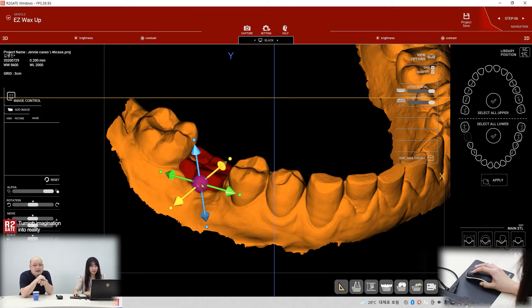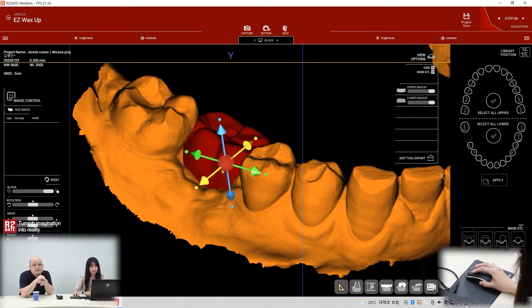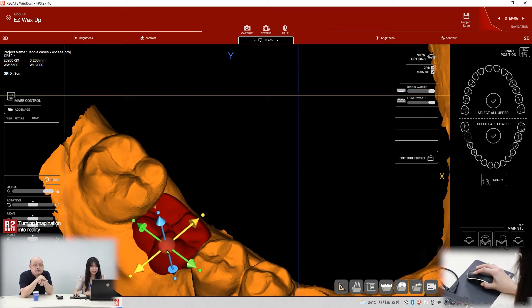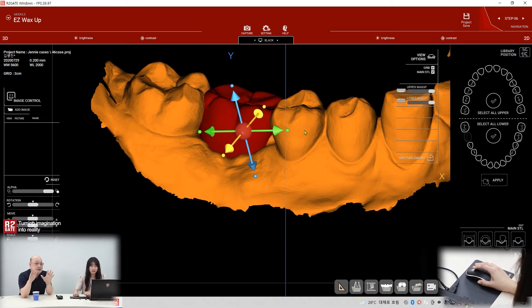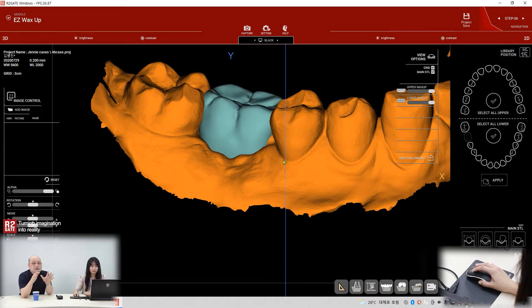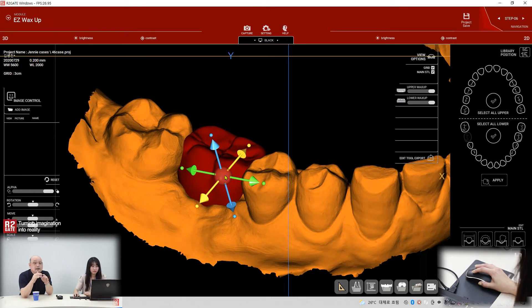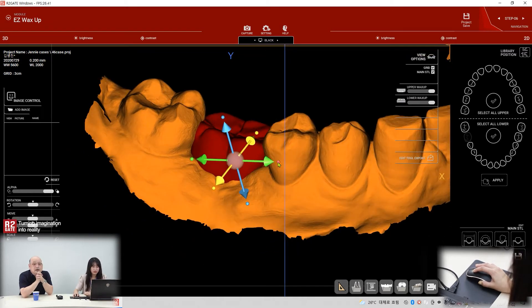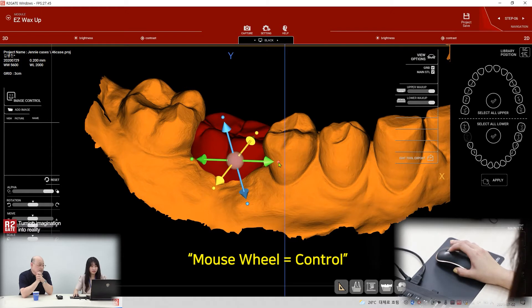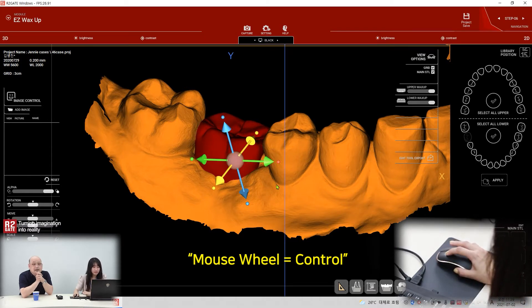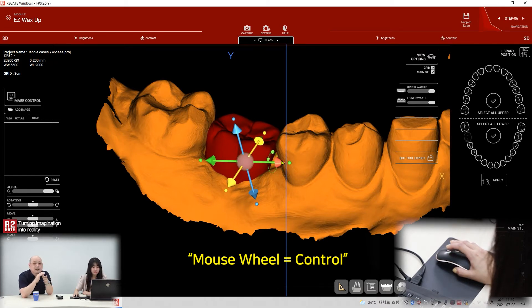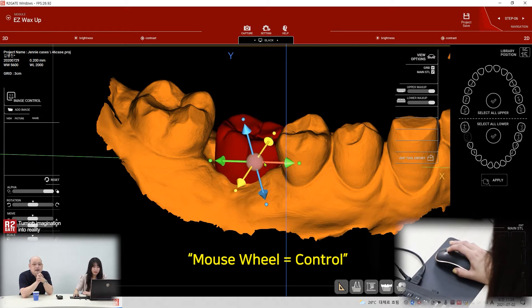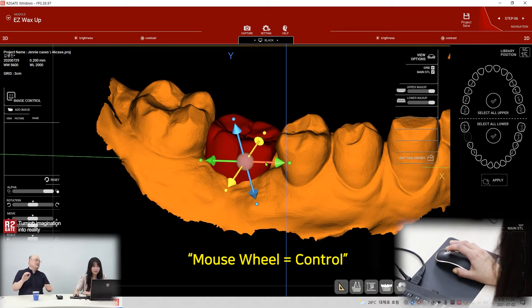That's the control buttons — move up. Because it's a diversity wax up, so it doesn't have to be a perfect wax up. It just decides the position of the implant; that's enough. You can control the tooth size with the scroll button — scroll is key. After the rotation, that's the scroll also. Everything is controlled by scroll. And for movement, click the bar. It's very easy, that's why it's called easy wax ups.